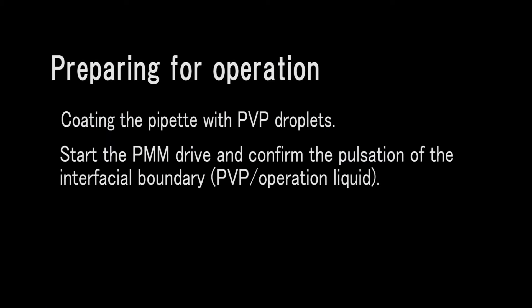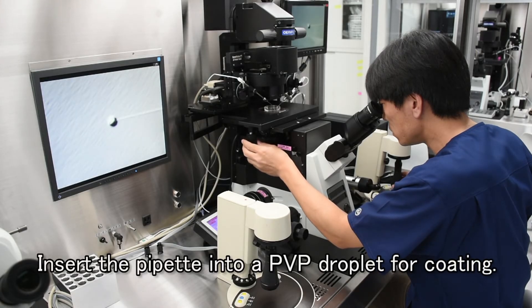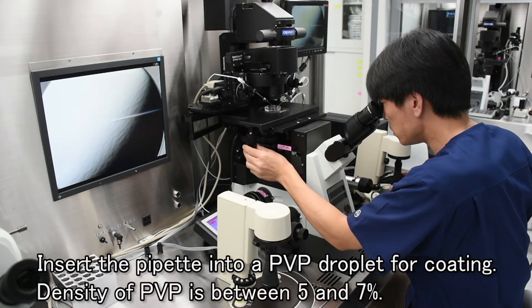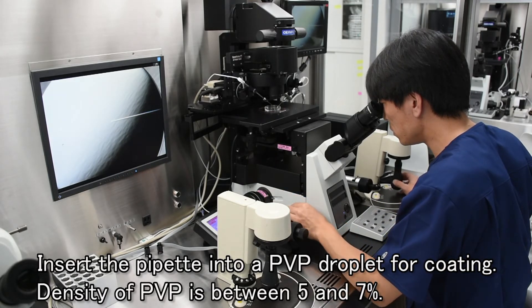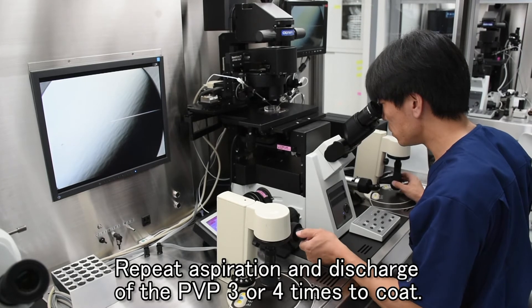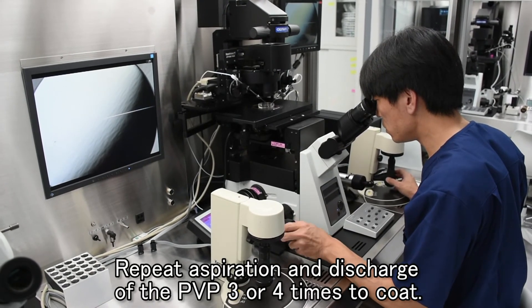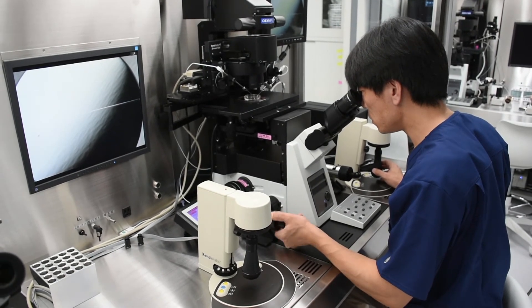We'll now explain sperm immobilization and preparation for the ICSI operation. Stable operability is gained by coating the pipette with polyvinyl pyrolidone solution, referred to as PVP. A light type of oil is recommended for covering the droplet on the dish; a heavy type will decrease the effectiveness of the PMM. Insert the head of the pipette into a PVP droplet and coat the inner wall of the pipette. The recommended density of PVP is between 5 and 7%. A density of more than 10% decreases the effectiveness of the PMM. Coating is achieved by operating the injector vigorously to repeat aspiration and discharge of the PVP three or four times, until the interfacial boundary between the operation liquid and the PVP slides smoothly.